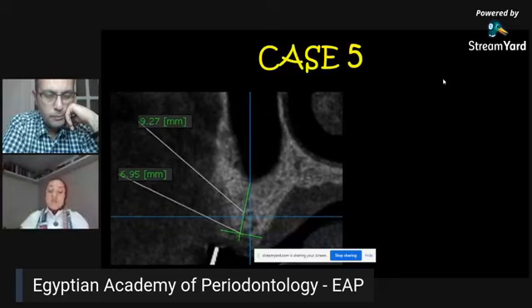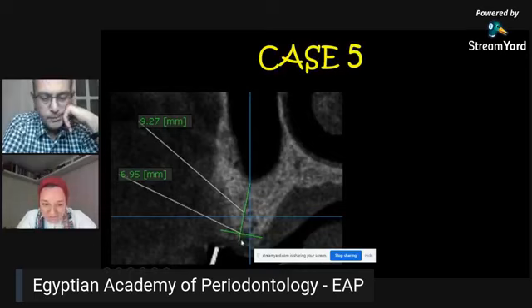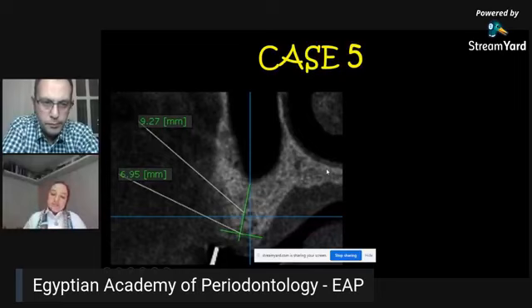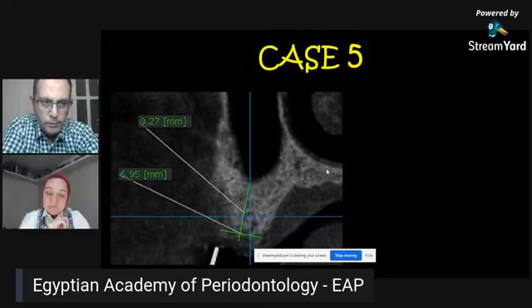So here we have a height of 9.2, maybe less, because after I put the screenshot, I found that I measured a little bit more. So this is perhaps 8.9 or 9 millimeters of height. Usually you need to put a regular implant of 10 millimeters, and you need 2 millimeters of safety margin between your implant and the vital structure. So if you're going to place a 10 millimeter implant, you need a minimum of 12 millimeters.